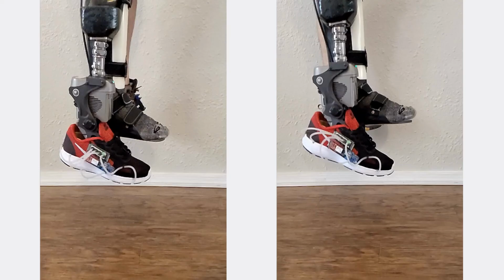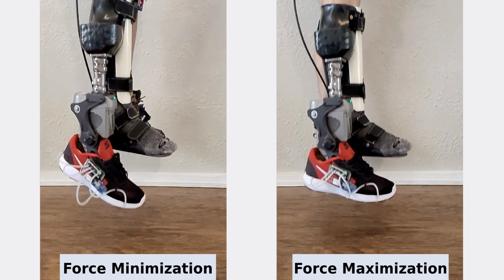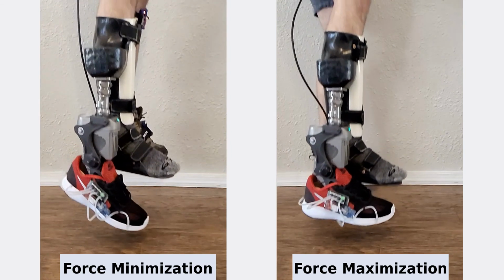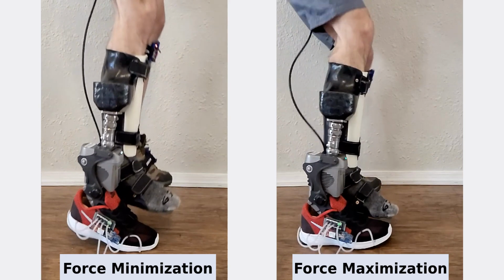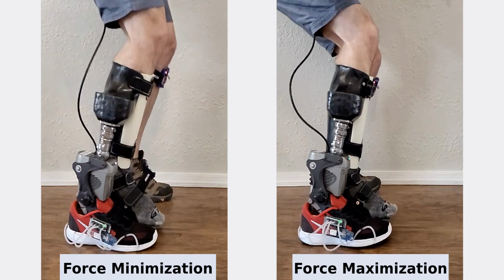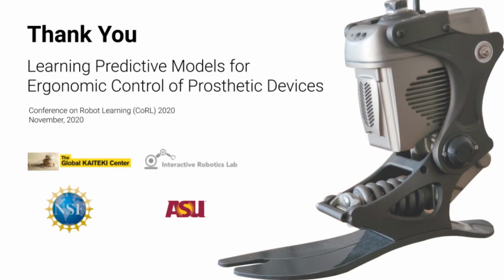Note that in a side-by-side comparison of knee force minimization and maximization, the ankle angle begins to move while still in the air to adjust for the desired angle during landing. When the foot touches down, the force minimization control has already extended the toe to help catch the weight in a soft and controlled manner, whereas the force maximization control has pulled the toe up to hit with full force, further illustrating an optimization of the current trajectory given future state predictions.